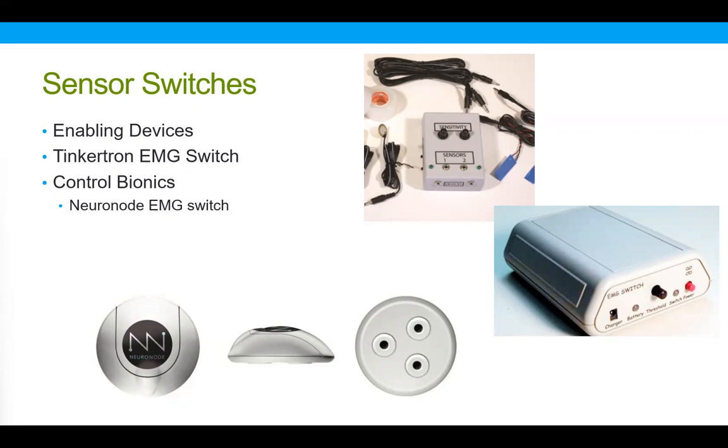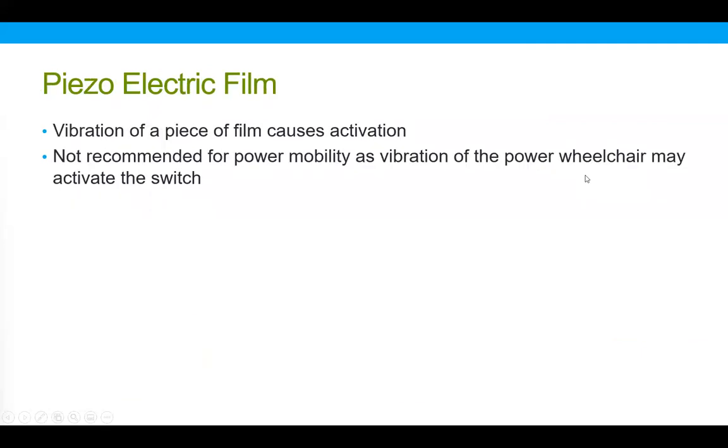Jackie has said, "I just did trials with the NeuroNode on 2 kiddos yesterday, and it was fun to work with." That's great. That's awesome. So some exciting newer options. So Enabling Devices, kind of old school sensor. There used to be a number of those on the market, and then these two much newer options.